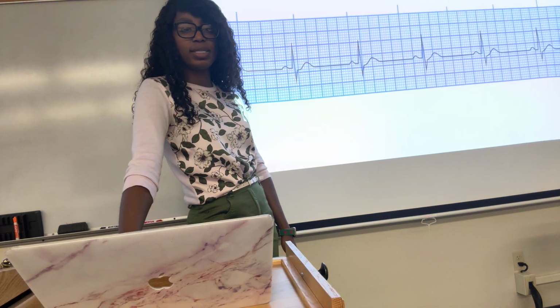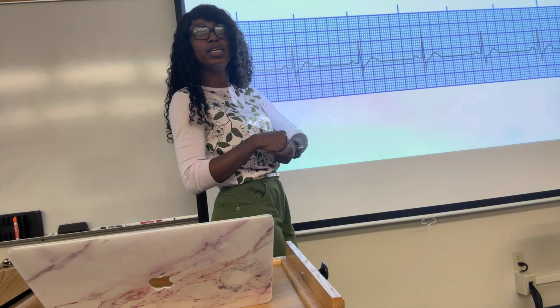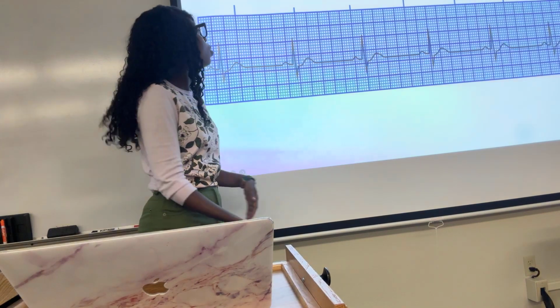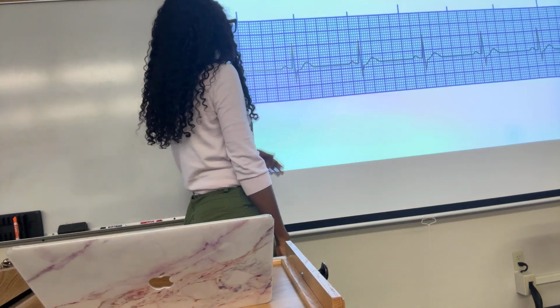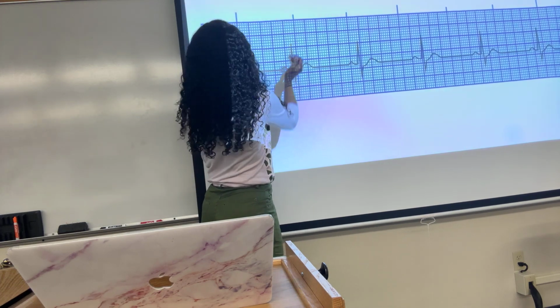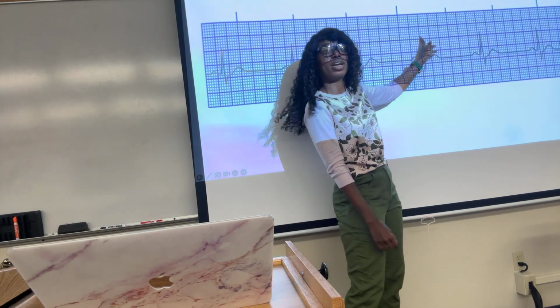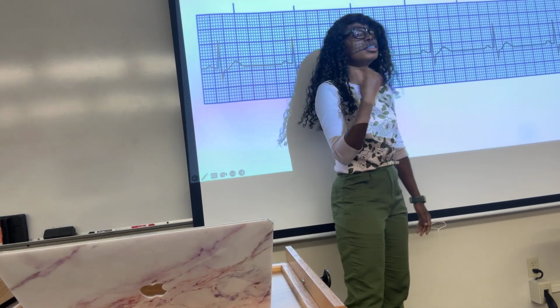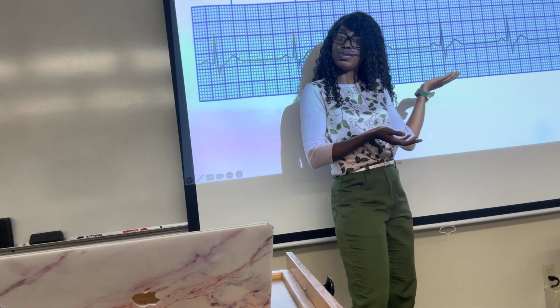Okay, so now sinus arrhythmias. We have sinus bradycardia. So bradycardia is fast or slow? Slow. So this is regular, right? So if it's regular, if we were to measure, I don't want to pick that one. I don't want to pick that one. Oh, I like this one. It's right on there, right? So we would pick it. If we couldn't tell, then we would do the 1500 or the 300 rule because it's regular, right?